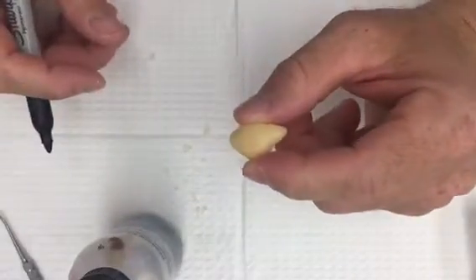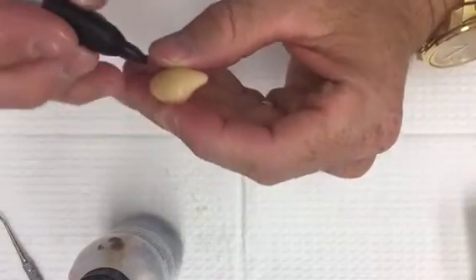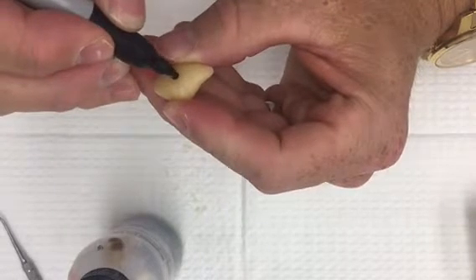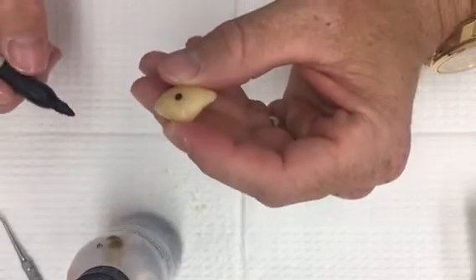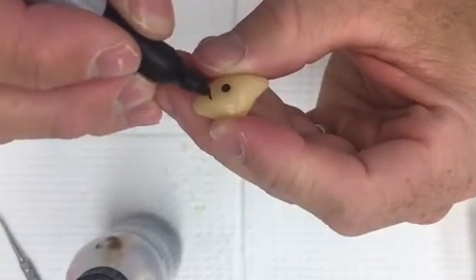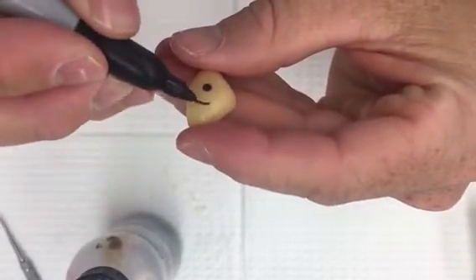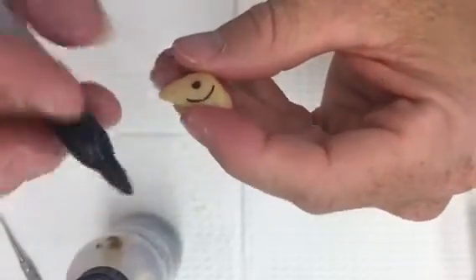After you like the shape and it's fitting comfortably, you need to draw the location of the iris. I start that by drawing the pupil — just a little circle like that. Once I have that circle, I'll just follow the outline of my pupil. This is a Sharpie, if you can't see.